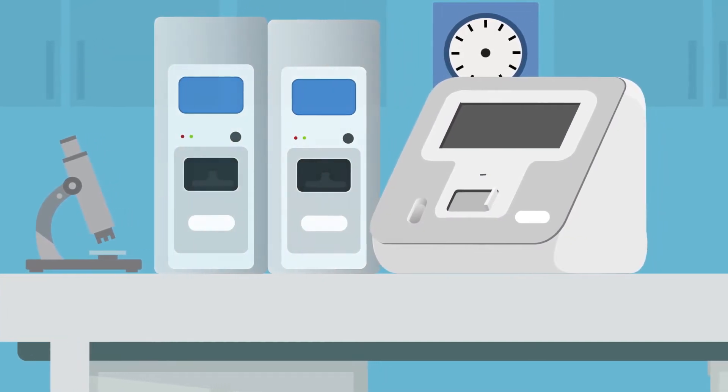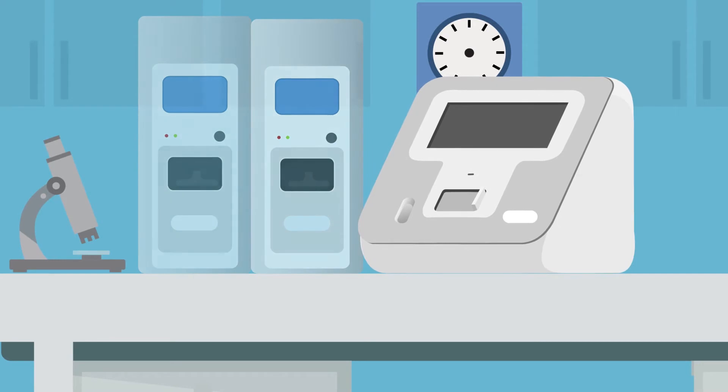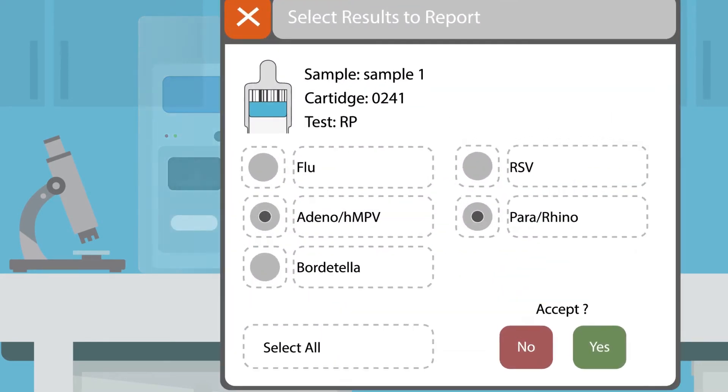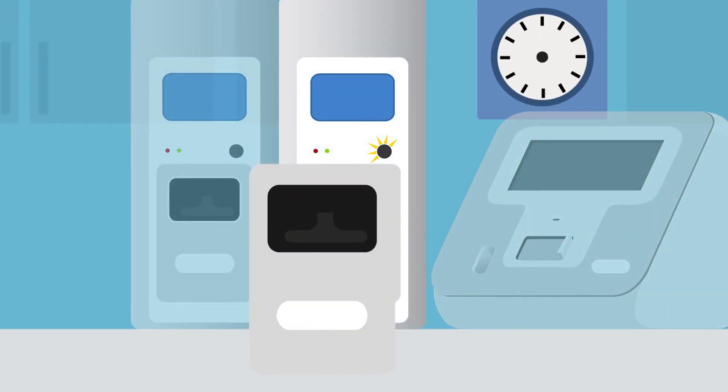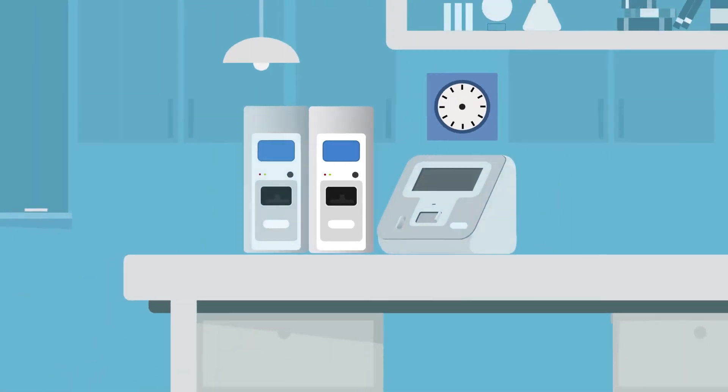The Verigene Reader serves as the user interface and central control unit for the Verigene system, storing and tracking information throughout test processing. The Verigene Processor SP performs all the automated test processing steps, including specimen extraction, target amplification, and hybridization.